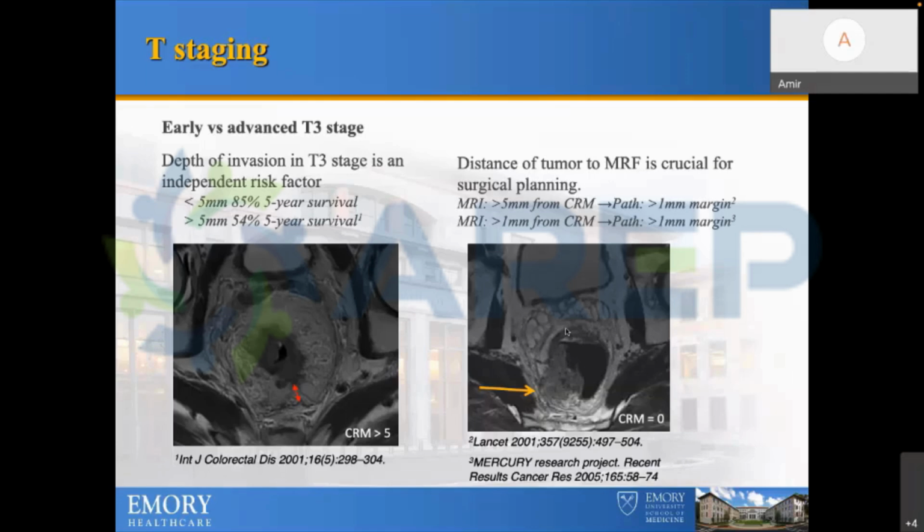Yeah. So if you follow the Society of Abdominal Radiology, SAR, website, or I think RSNA probably has some templates for rectal cancer staging as well. I think the SAR one is the best one for structured reporting. In the body of the report, you're going to use the same descriptors, meaning how far the tumor is into the mesorectal fat, how far it is from the fascia.